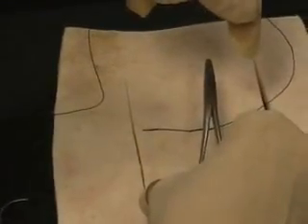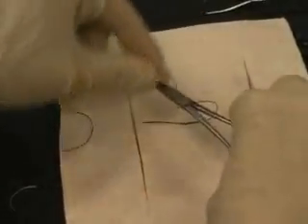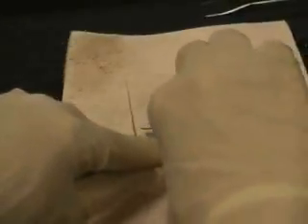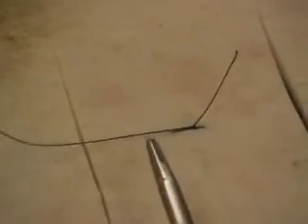And we're going to follow those 3 steps again. So we're in between the 2 suture ends, over just 1 time this time, grab the tip, and we're going to trade sides. Make sure I get that. Trade sides. You see the nice circle? We're going to trade sides. That's 1 knot. We're going to go ahead and place about 3 knots.